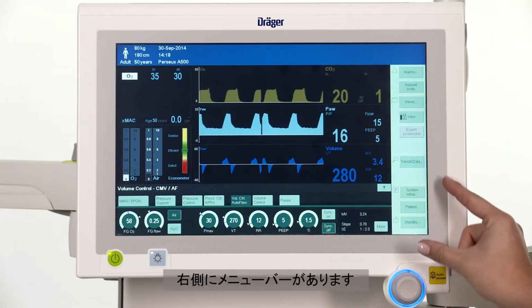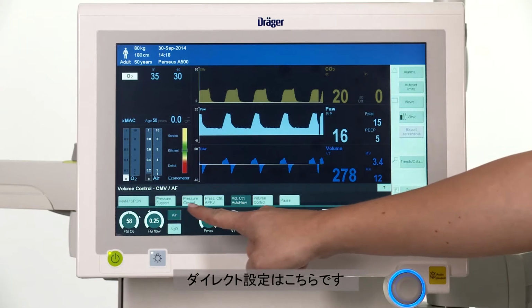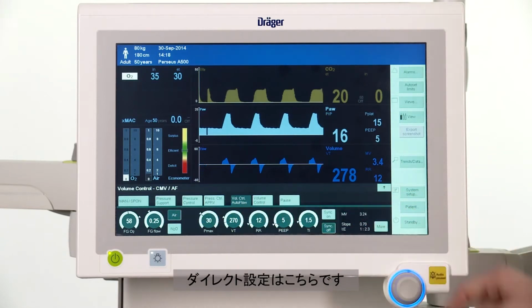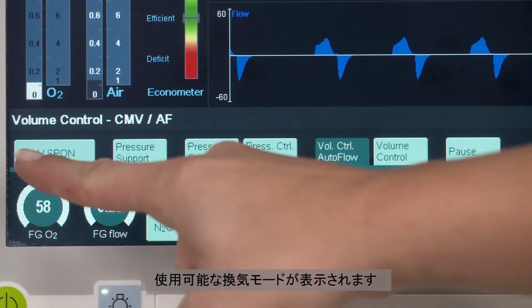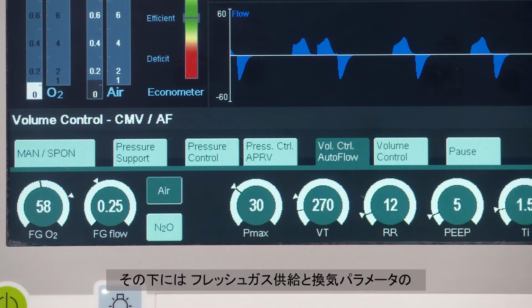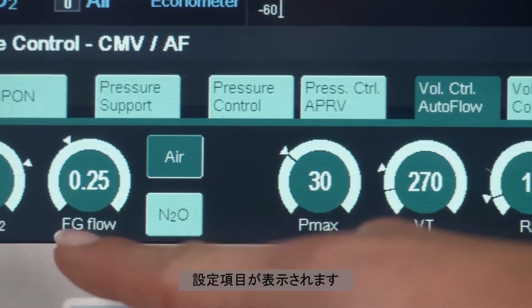You can see the menu bar on the right side. And the therapy bar is located here. The therapy bar displays the current ventilation mode and the available ventilation modes. Below that, you will find the therapy control for fresh gas delivery and the ventilation parameters.